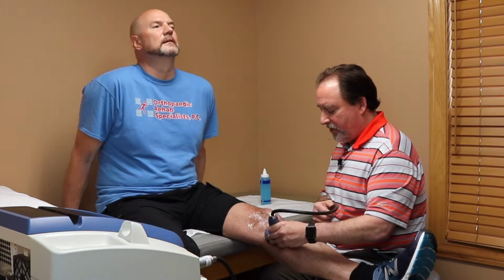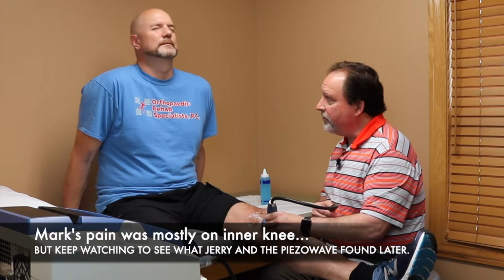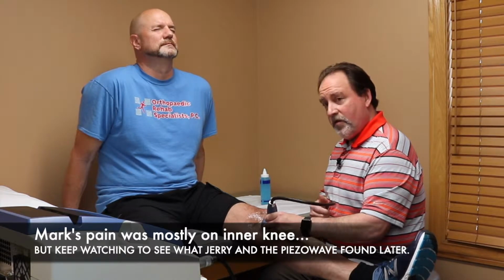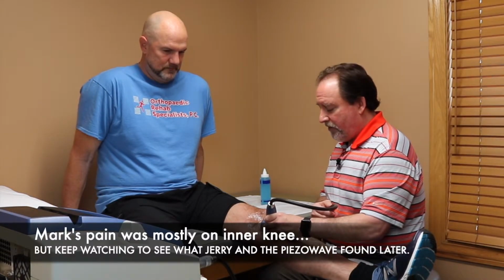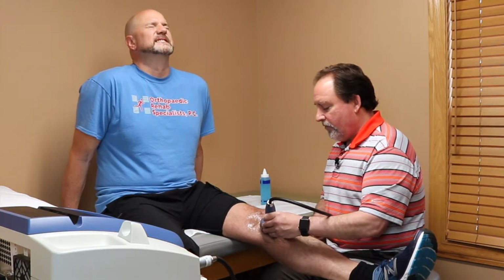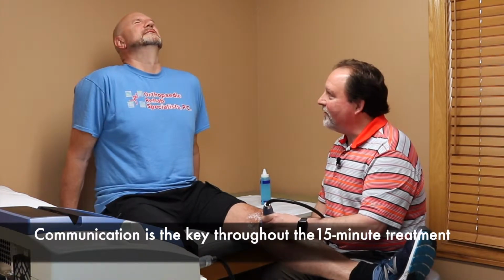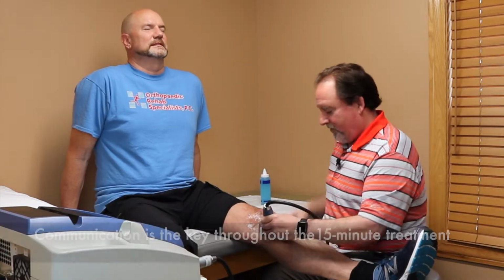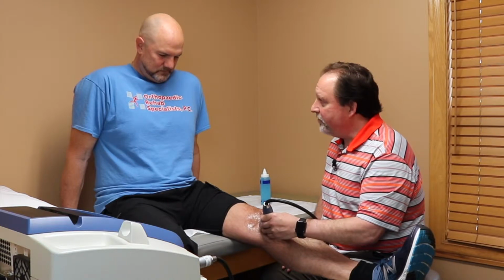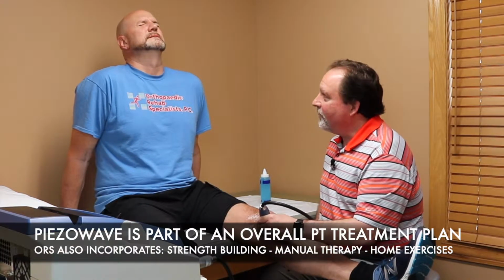Okay, I know we've hit that spot before. Let's find another one. How about there? That's it. Oh my. Is that too much? Nope. But that's the spot. Now, if that is too much, we can turn it down a couple of notches. That's no problem. Let's back that down just a little bit. Better? That's the money spot. Still? Too much? Probably still a little bit too much. You're not supposed to be grimacing that much, Mark.